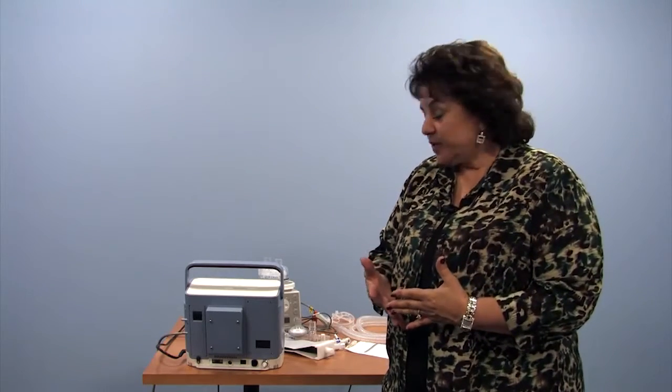And parents always say to me, how much oxygen do I know how to provide into the ventilator? You will have a prescription for your child for liters of oxygen for different devices. It might be for a nasal cannula during the day when they're off this device. It could be for a heat moisture exchanger for the tracheostomy tube when they're off the device, and for the device itself. The prescriptions typically are liter flow.